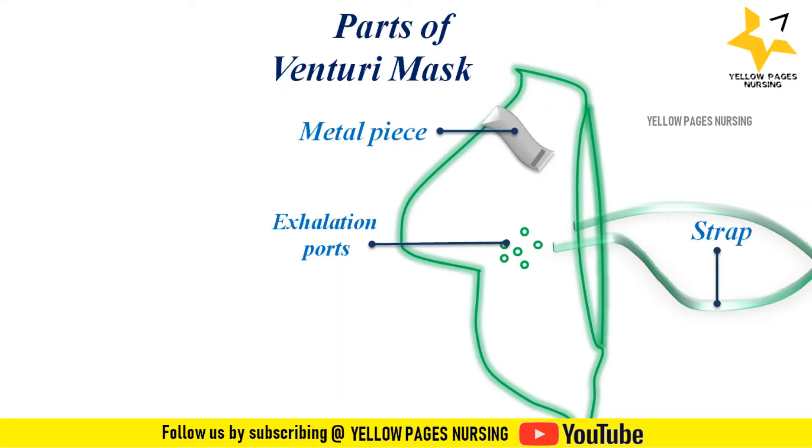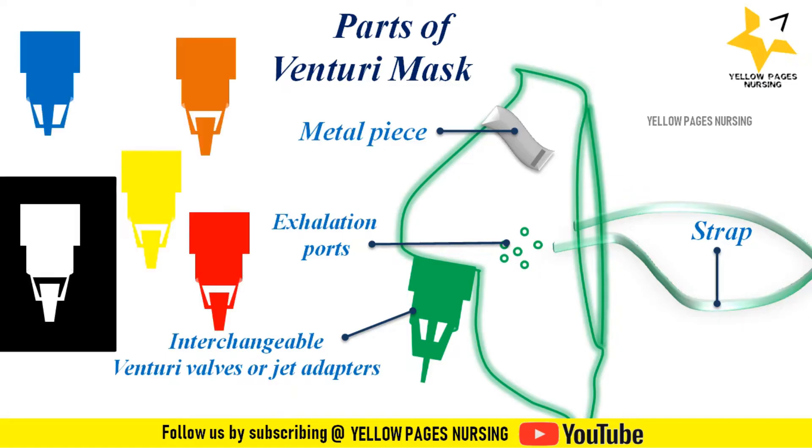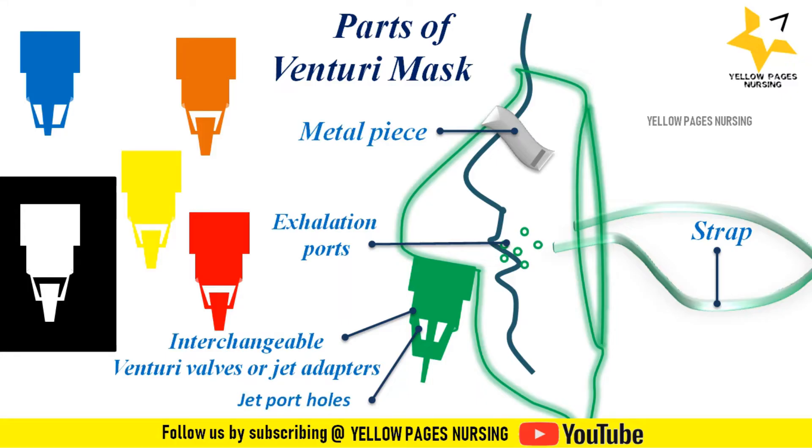It has interchangeable Venturi valves or jet adapters. Different colored Venturi valves are available to supply specific concentrations of oxygen. It has jet port holes. These masks use the Bernoulli principle to entrain room air, where pure oxygen is delivered through a small orifice of the Venturi valves. The exit gases are rapidly flushed from the mask via its holes, so there is no re-breathing and no increase in dead space.